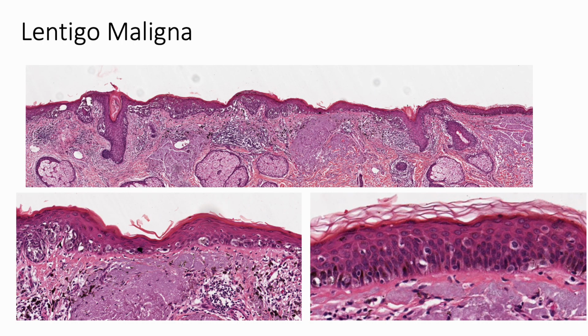Next is the histology of lentigo maligna. If you remember the normal histology, the melanocytes should be separated apart at the dermal-epidermal junction. But from this picture, you can see that in the background of severely sun-damaged skin, the epidermis becomes very busy. You can see there are random nests of melanocytes with tons of pagetoid extension. As depicted here, you can see those abnormal-looking melanocytes with many pagetoid cells. So those are the features of lentigo maligna.